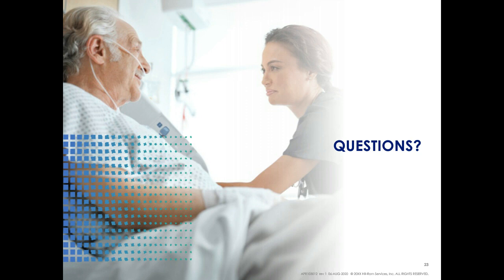And so we can not only automate the collection of that measurement, but at the vital signs monitor level, we can also automatically calculate an early warning score on a patient using not only respiration rate, but the other values that you've measured during that session of collecting vital signs on that patient. So when we do that, we present a clinical message at the bedside that takes all those vital signs into consideration and calculates a score for that particular patient.